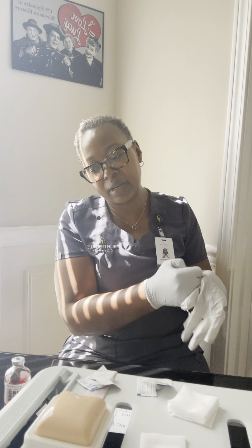Okay, so before I inject this, I should also let you know that when we inject, you may experience some stinging or burning sensation. This is normal, but when it continues getting worse, you should let me know, or you should let the physician know. So then I'll go ahead and perform hand hygiene and don clean gloves. I will be giving 1 ml of heparin based on my calculation.